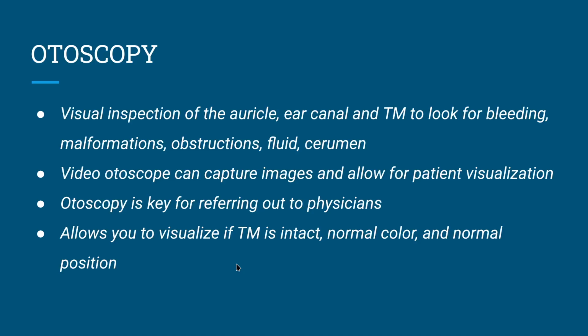A video otoscope may capture pictures and allow for patient visualization. This is usually of more interest to adults than children. It can be helpful for documentation for referring physicians, but the difficulty is how are you going to send that image to them? Email is often an option. Secure email is often an option now. It's not going to fax very well, though.